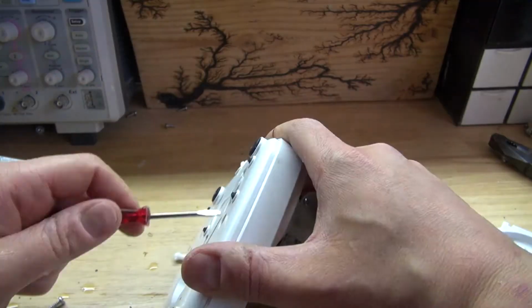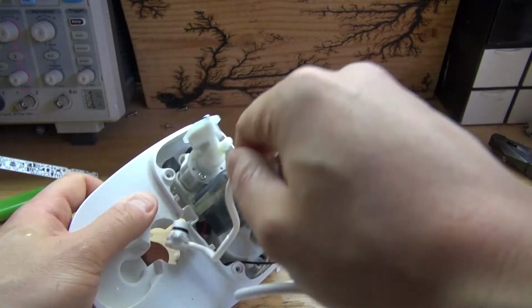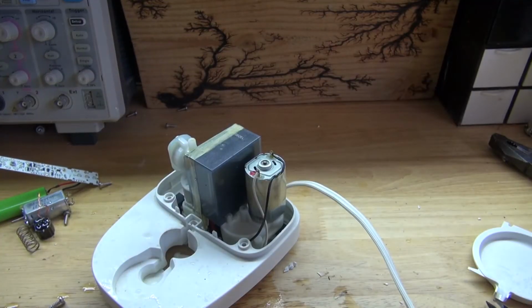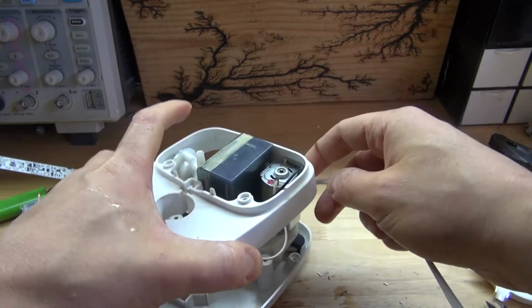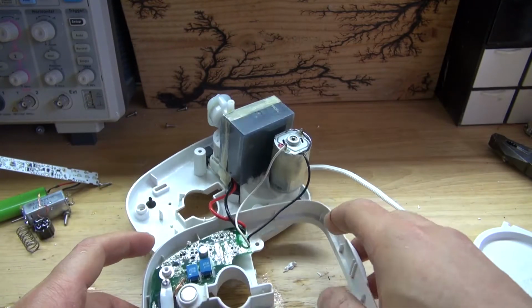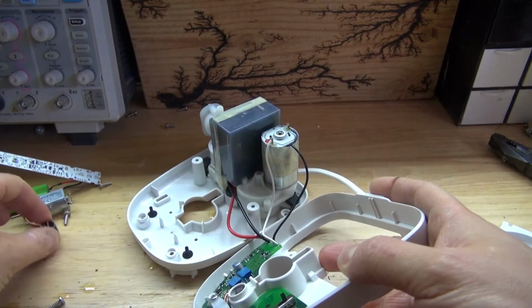I'm going to go ahead and pop this part out. And there we go, this part's useless, so throw it away. And now open up the second part of the housing. Oh, and as you can see, it's another circuit. Okay, I found the second half of that transformer.